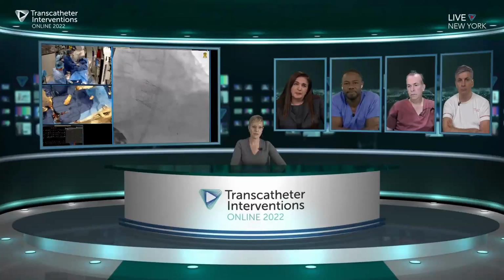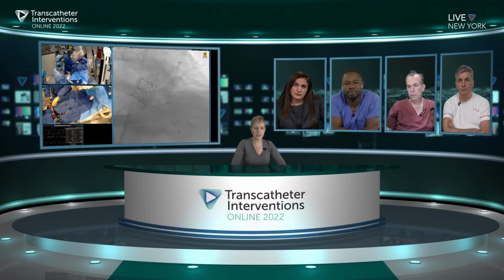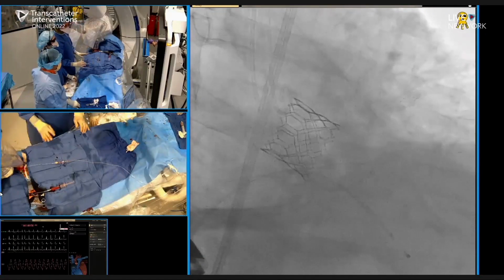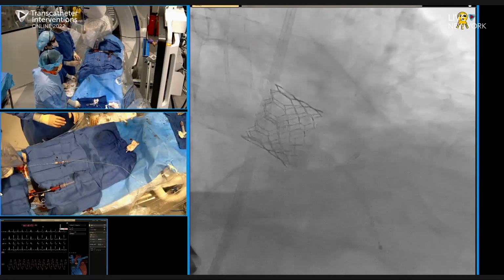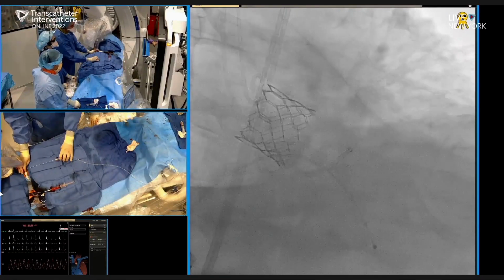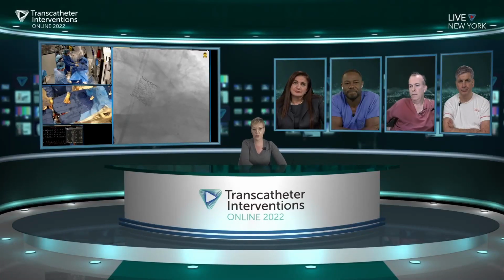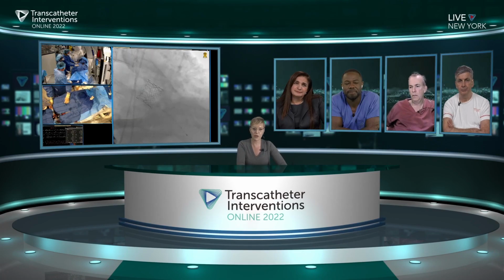Yeah. If this was a 65-year-old, and that's where I was going, you would have had surgery. The central leak resolved with the wire out. Patient preference now plays into it. And you know now, if you have a 65-year-old who's refusing surgery, you still should be treating him. And the question becomes, Didier, is it okay to leave mild? Is it okay now to leave mild?